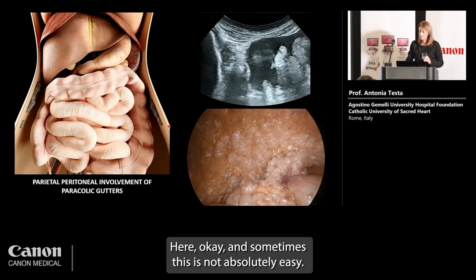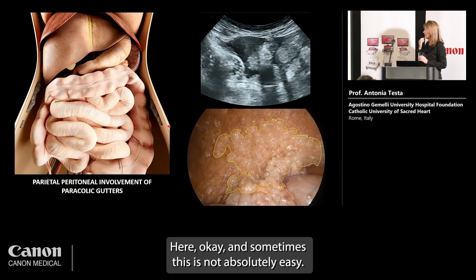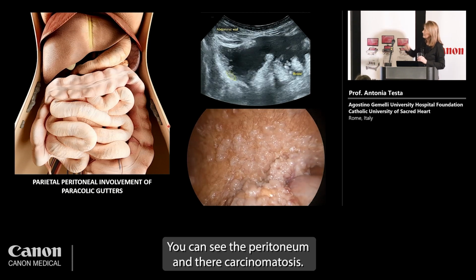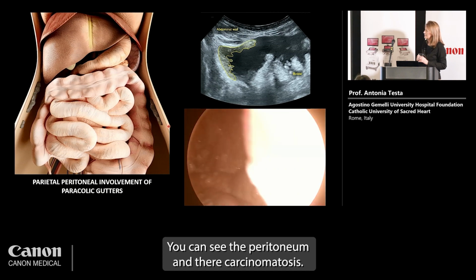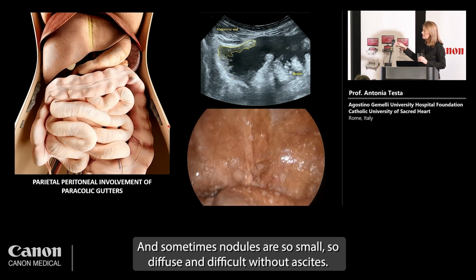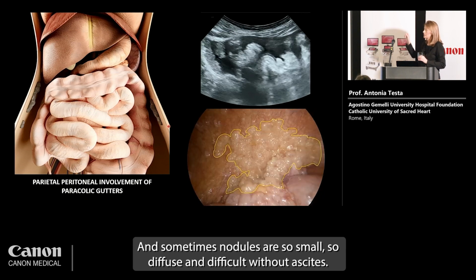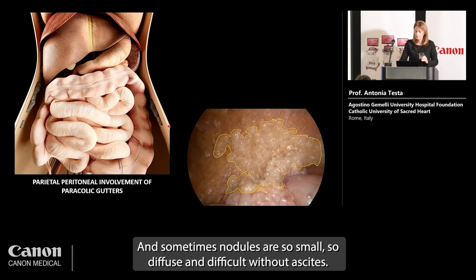Okay, and sometimes this is not absolutely easy. You can see the peritoneum and their carcinomatosis. And sometimes nodules are so small, so diffuse, difficult without ascites.